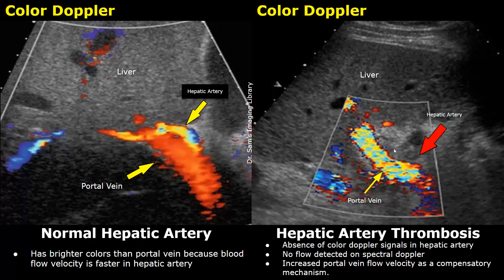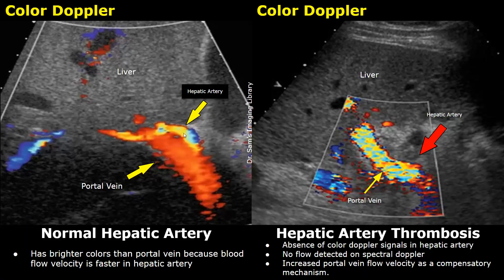In the right image, we have a case of hepatic artery thrombosis — a rare but serious complication of liver transplant. In this case, a thrombus has occluded the hepatic artery. We do not see color signals in the vessel next to the portal vein, meaning blood flow in the hepatic artery is absent. This led to increased turbulent flow in the portal vein as a compensatory mechanism, and we can see a mixture of colors in the portal vein.